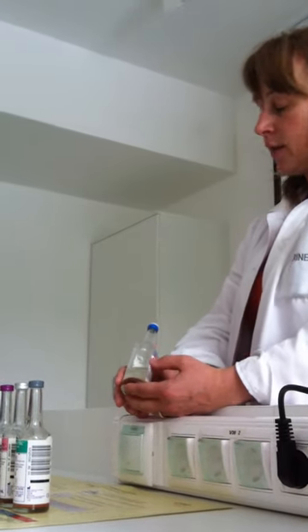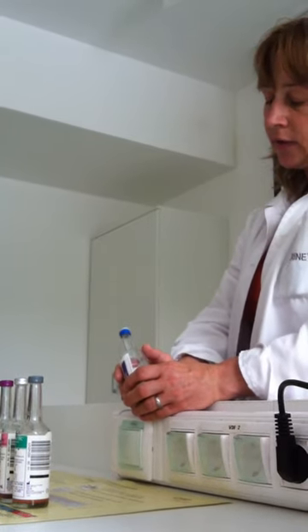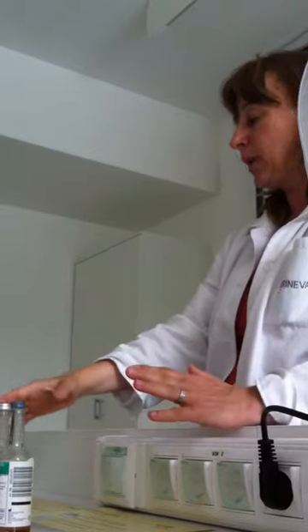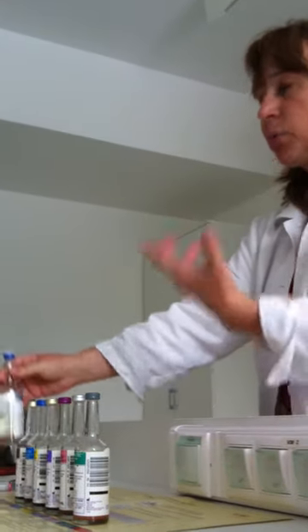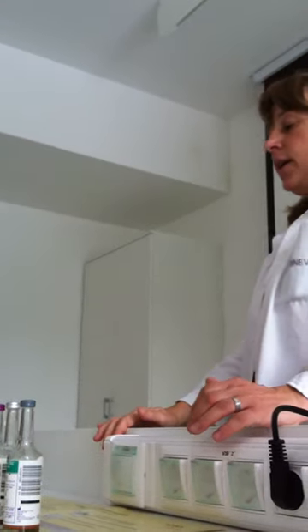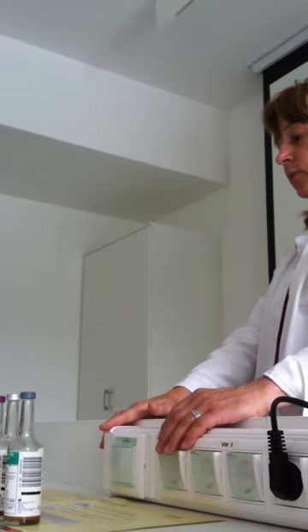a carbon dioxide production, and it's measurable, and the equipment permanently checks this. If it is increasing exponentially, that will be an alarming sign, a sound, and on the screen you can see that there is a positive bottle. You will see its position in the equipment, because it is well organized, and it gently moves the bottles and always checks the carbon dioxide production.